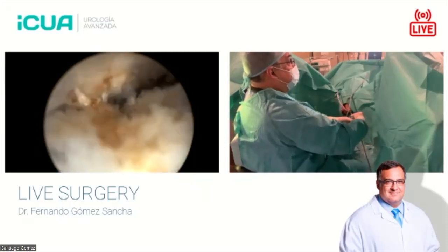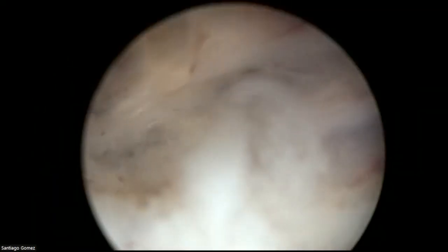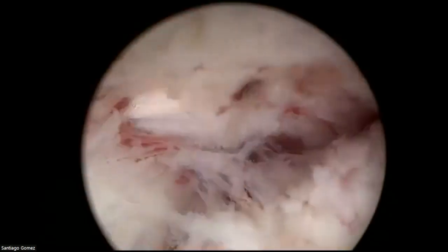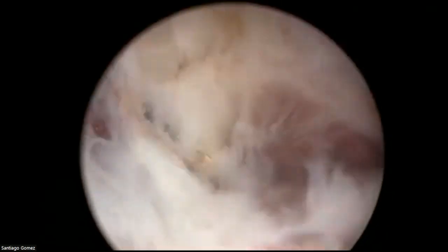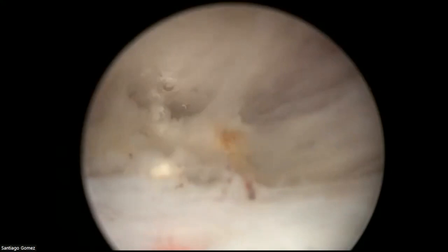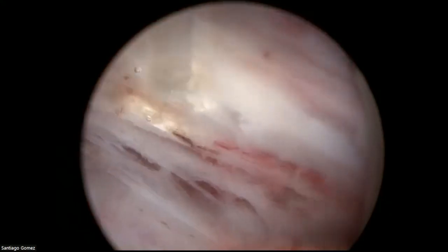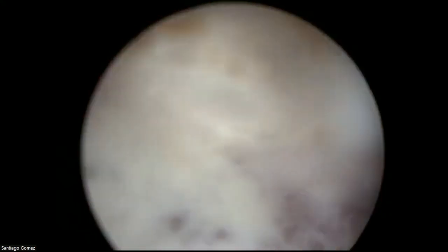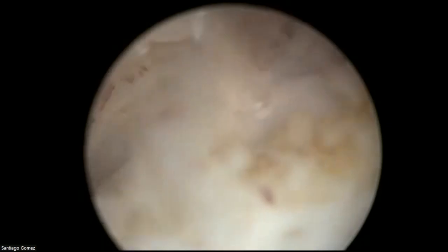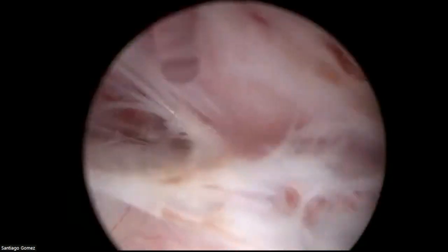And now I will try to construct the anterior line. The anterior line sometimes needs some more work. You have to judge if the depth that you are taking is good enough or not. Sometimes there is a risk of leaving some adenomatous tissue in this area at 12 o'clock. So I don't want to leave tissue, of course, and I want to work on the anterior line, follow the arc. You think on the MRI image, and if you look at an MRI of a big prostate, you will see how the line is quite uniform, and we have it in our mind already, so we know the anatomy of the capsule, we know how it goes.